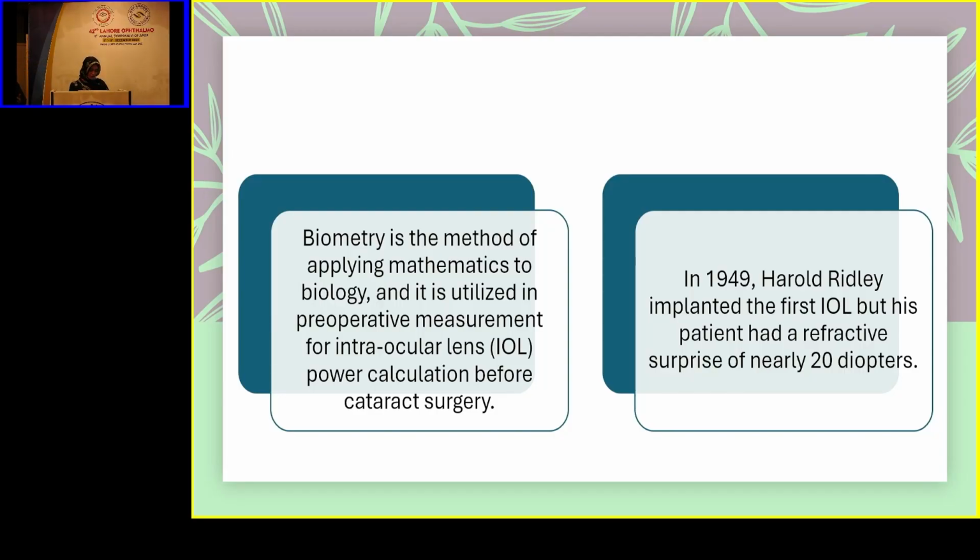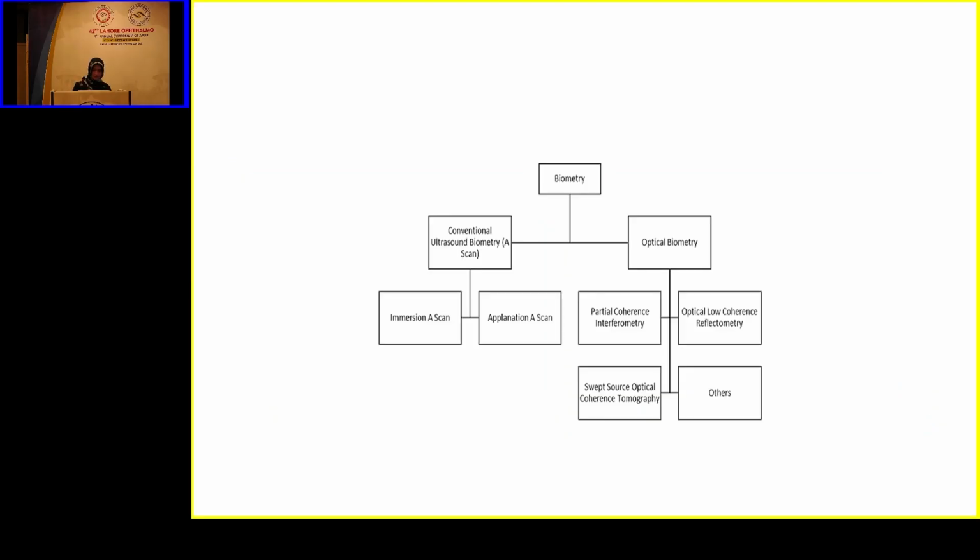And from then on, we've been on a quest to find some magical formula or machine to achieve emmetropia or intended refractive status. Briefly, on how we've progressed from contact to non-contact biometry, we had the ultrasonic biometry, and now we're working on the optical biometry.